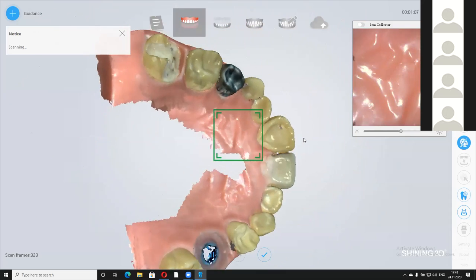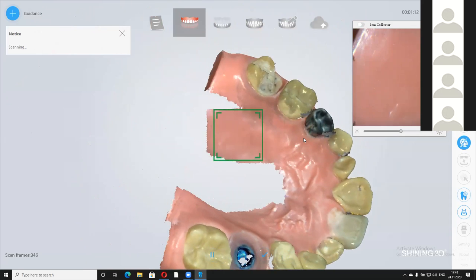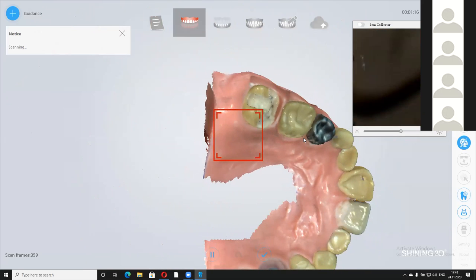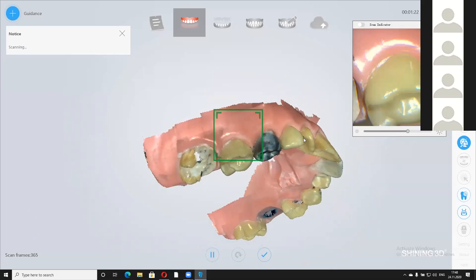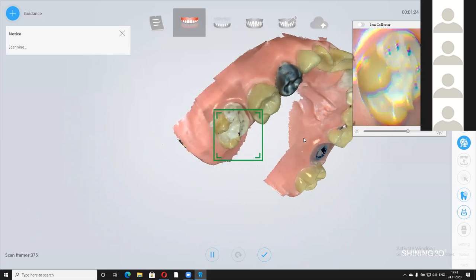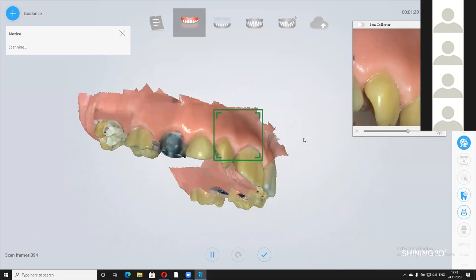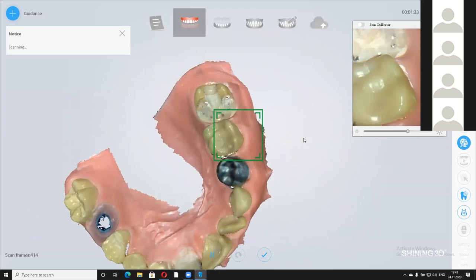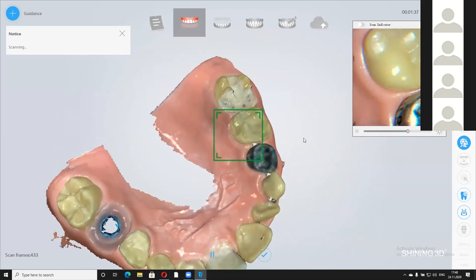Then when you scan, you basically, you know, let me put down the camera for a second so that you can see me better here. If I put it down, maybe you see, because I have to keep the thing so high up there. So once you've done your scans and you see everything is good, you check the area which you want, you see if there's still some holes, fix those holes, turn the camera in a different angulation, and the camera closes the holes.